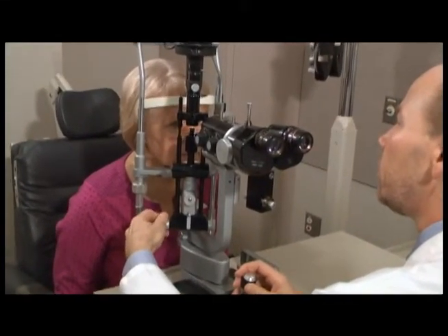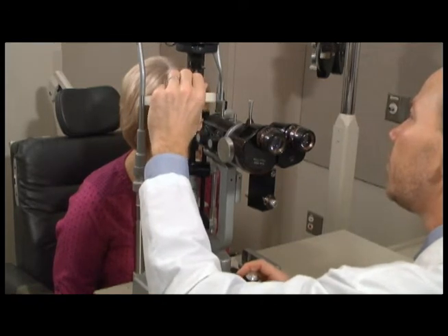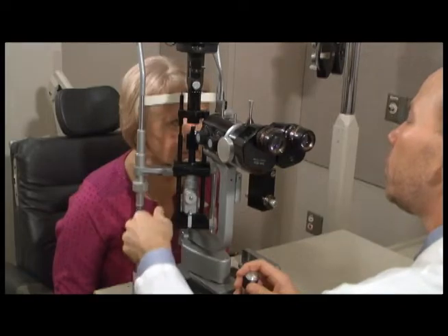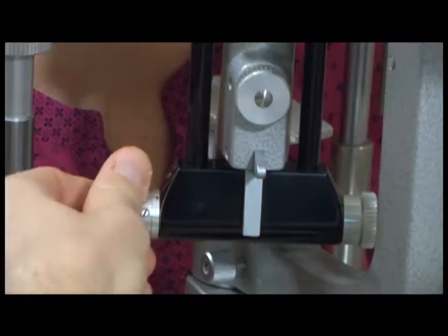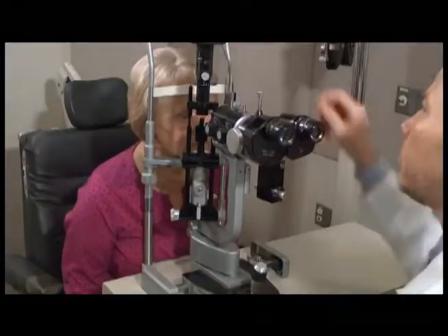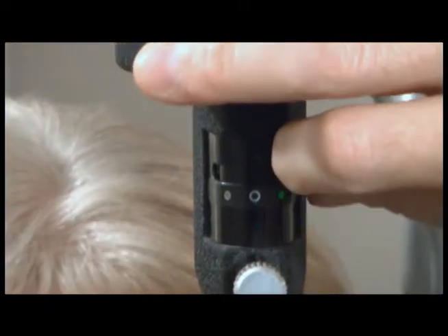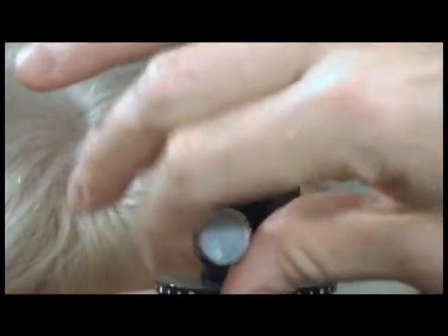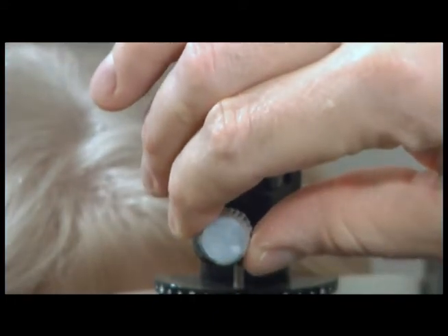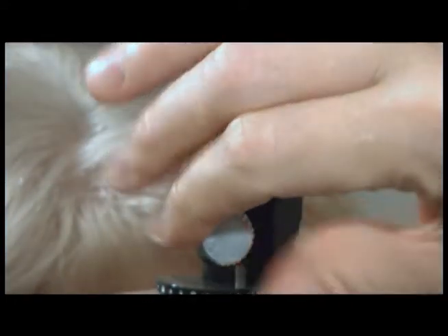The Haag-Strite slit lamp is a relatively complex instrument with multiple knobs. It is necessary to know what each of the knobs does in order to become facile in the use of the instrument. The knob inferior determines the width of the slit beam. The top knob determines the vertical height of the slit beam. The knob most superior determines the brightness and color of the slit beam.